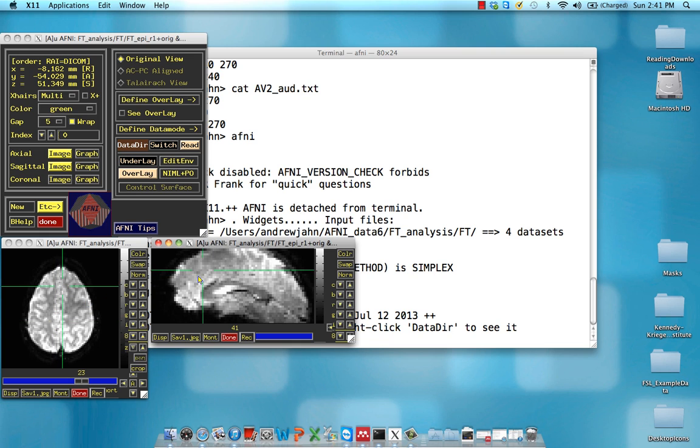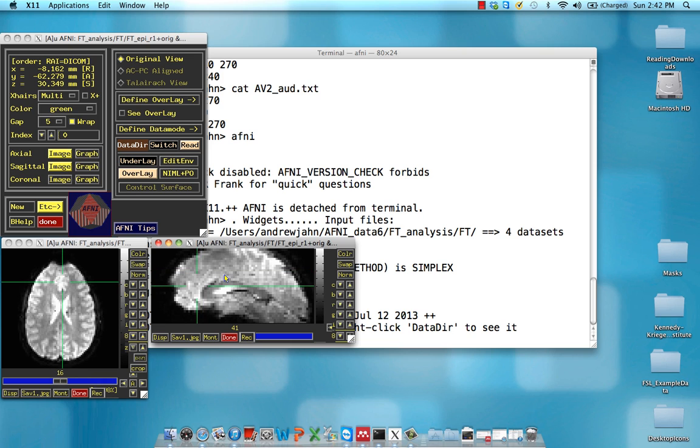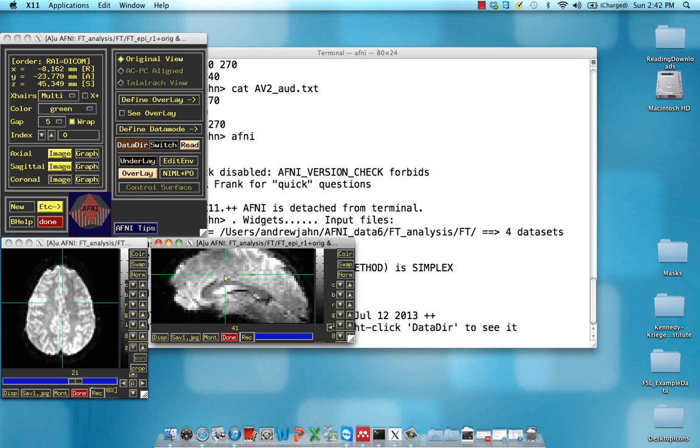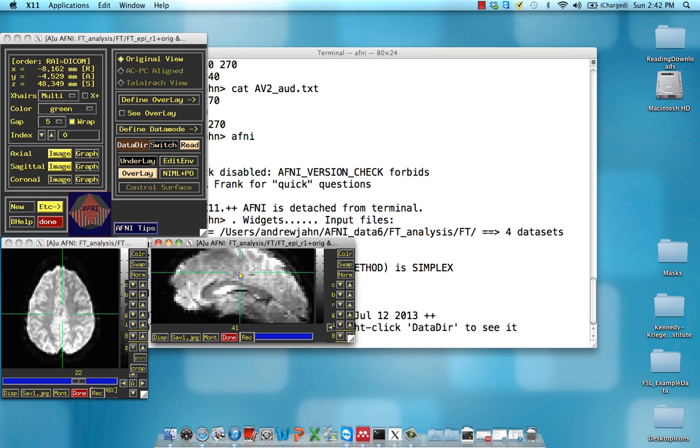And just for the record, if you haven't seen a functional dataset before, this does look relatively good. It's basically a blurrier image of that anatomical dataset we just looked at. That's because functional data has a lower spatial resolution in general than anatomical datasets.